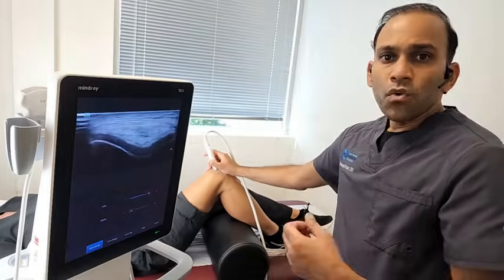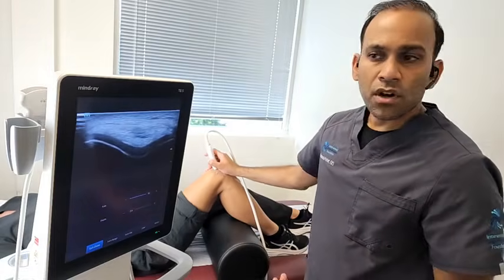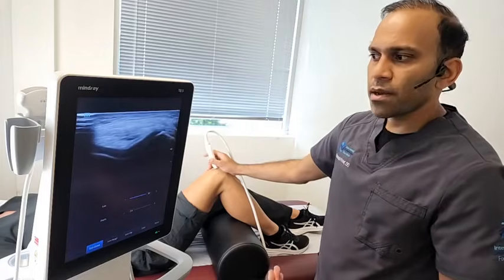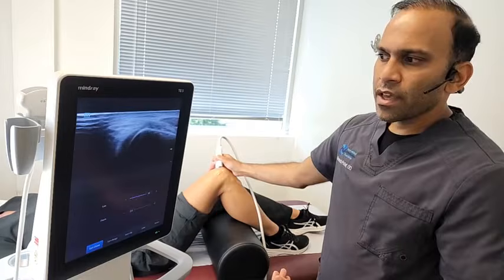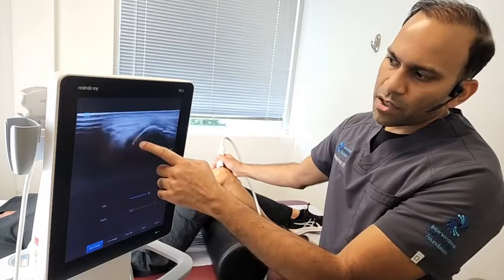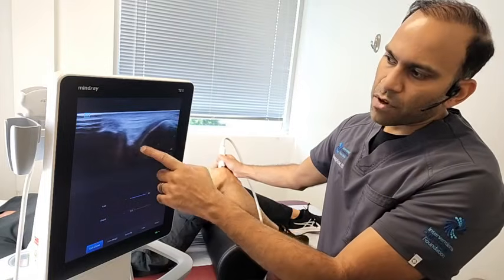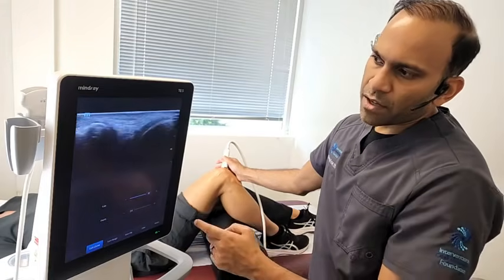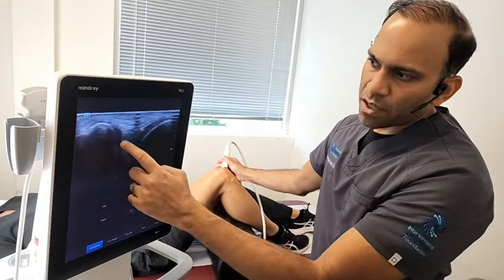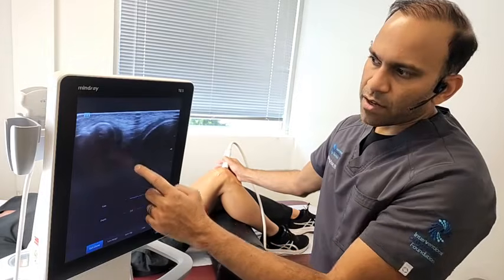Now, we can actually look at different areas of cartilage as well. So from here, when I'm scanning, I go to the medial side or the inside of the knee, and I take a look at the cartilage at the end of the femur, at the end of the thigh bone. This is the kneecap over here, and you can get a little bit of a peek at the cartilage on the undersurface of the kneecap there.